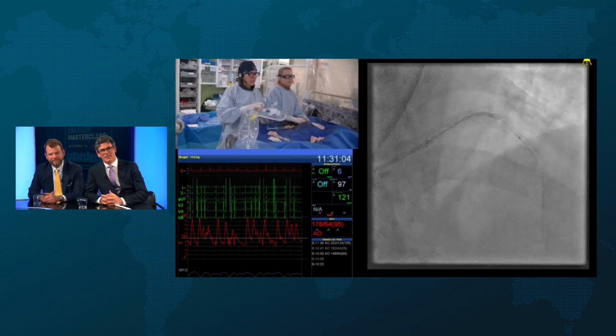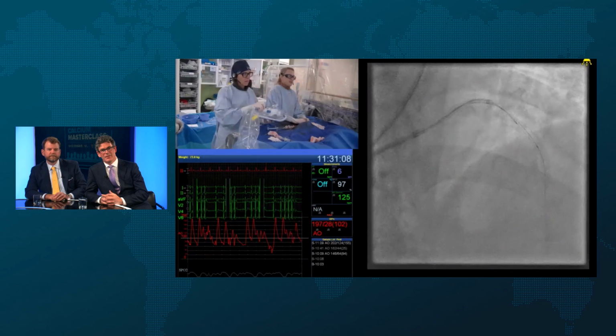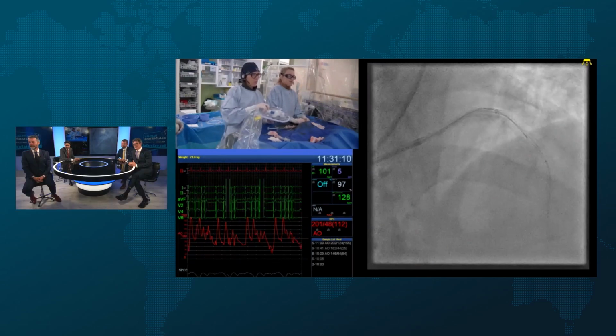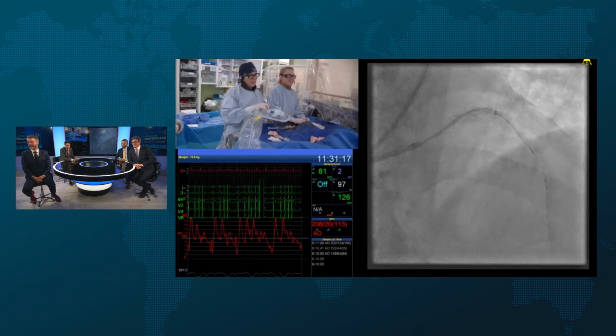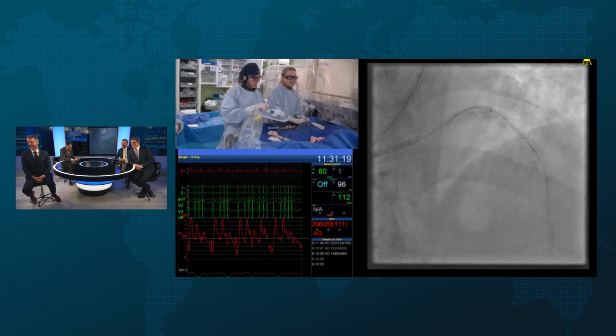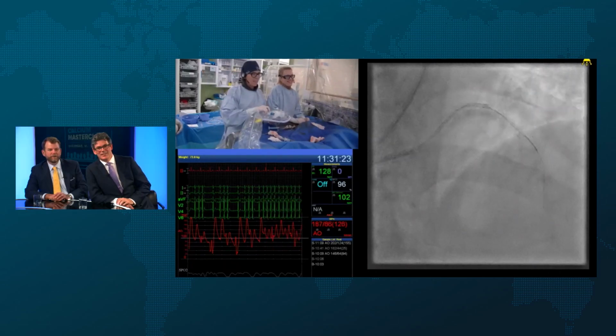It's all the physics of the catheter, isn't it? Yeah, well done. I don't think it's that. I think it's just this IVUS catheter's on its last legs. It's worked so hard, tired. There's a few bends in the back end of that IVUS catheter, I assume. I've just done it enough times to know that you've made yourself probably a hand grip at this point with the back end of the catheter.